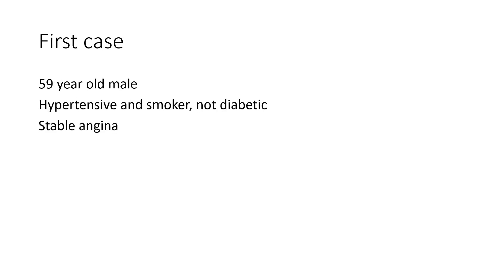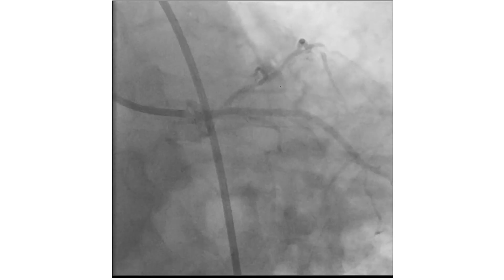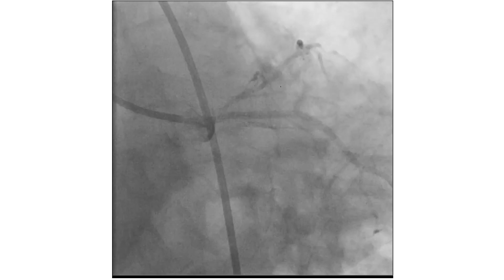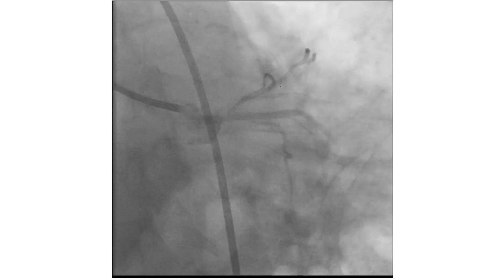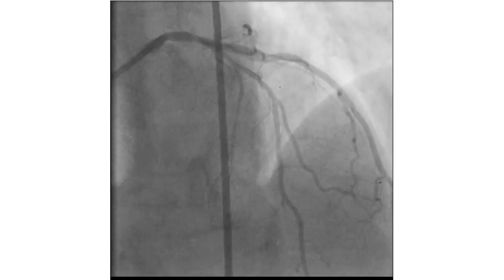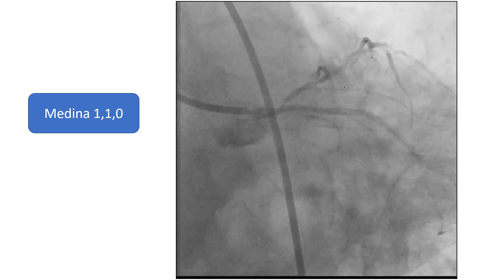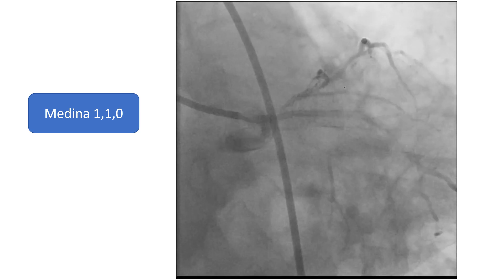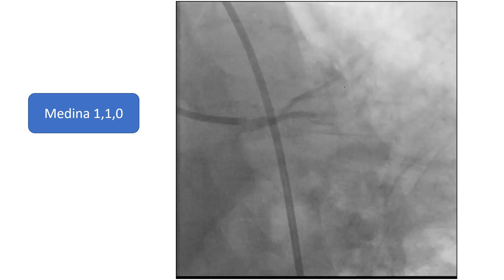The first case is a 59-year-old male who is hypertensive and a smoker, not diabetic, with stable angina. This is an apicaudal view of the left coronary artery. It shows a distal left main stem lesion with a critical lesion at the ostium of the LAD. The lesion is extending to the mid part of the LAD as shown in this cranial view. The lesion complex is continuous with a large OM, which appears to be free of disease, and the classification is Medina 1-1-0.